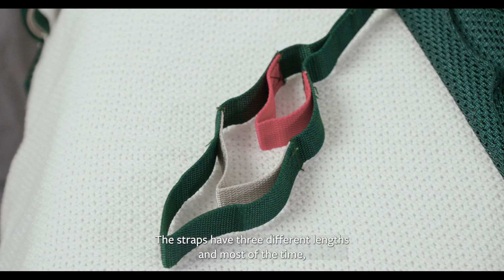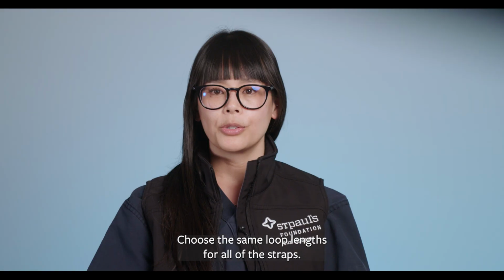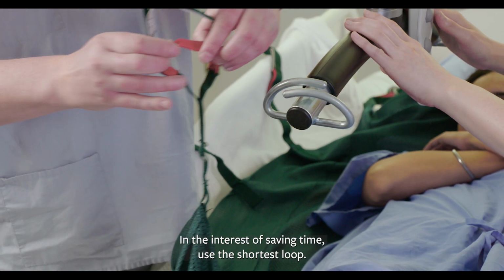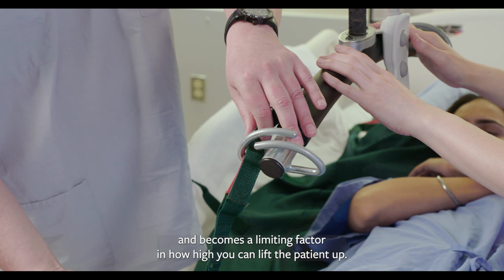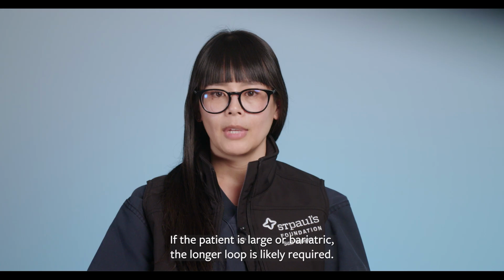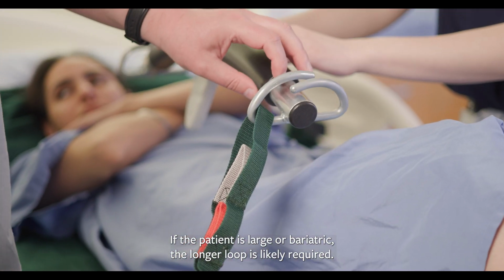The straps have 3 different loop lengths, and most of the time, it is a matter of preference for which one you choose to use. Choose the same loop lengths for all of the straps. In the interest of saving time, use the shortest loop. This may also be required if the ceiling height is low and becomes a limiting factor in how high you can lift the patient up. If the patient is large or bariatric, the longer loop is likely required.